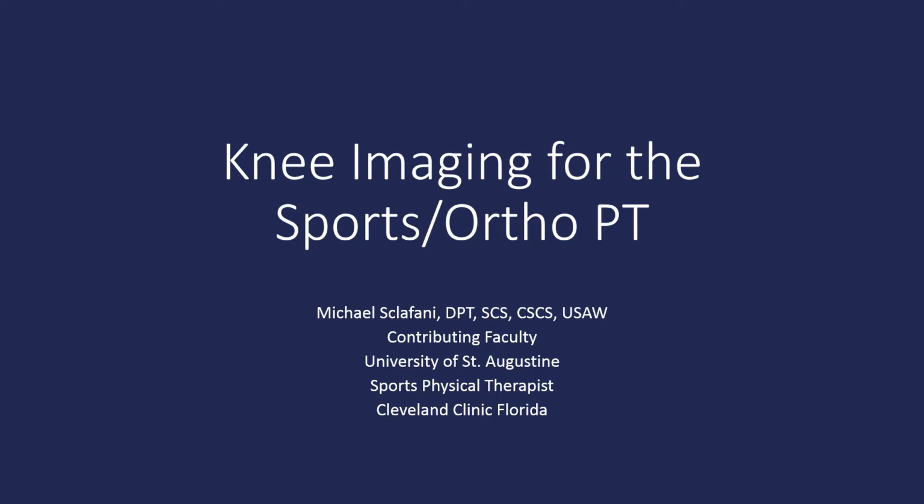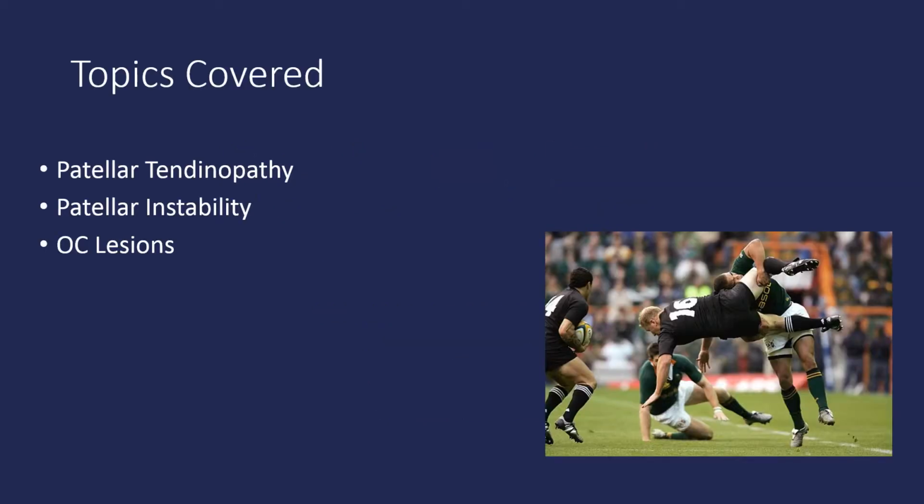Some orthopedic and sports imaging specific to the knee. We're going to be talking about three pathologies today: patellar tendinopathy, patellar instability, and OC lesions of the knee.